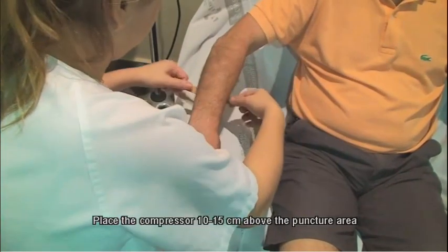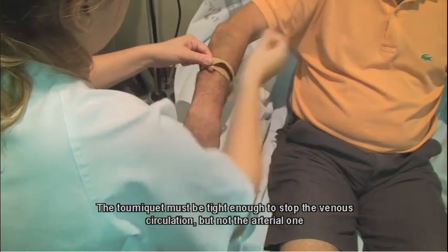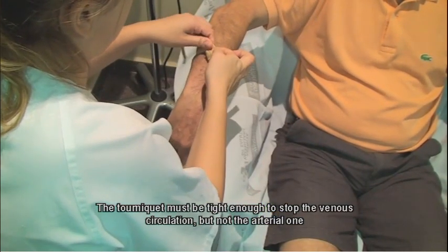Place the compressor 10-15cm above the puncture area. The tourniquet must be tight enough to stop the venous circulation, but not the arterial one.